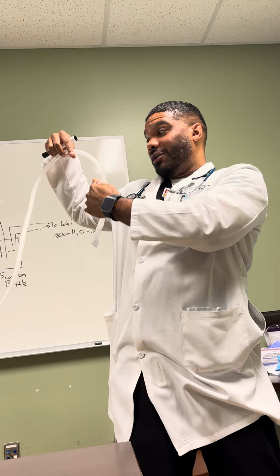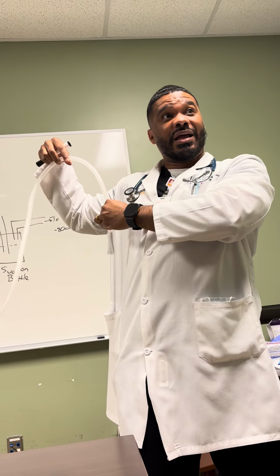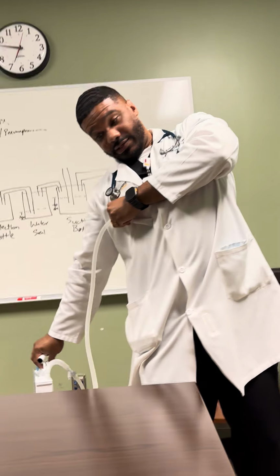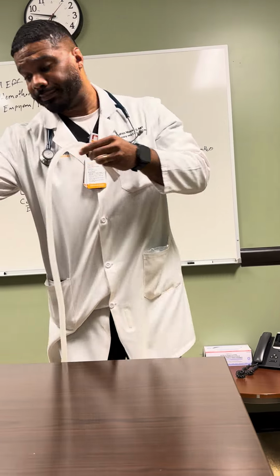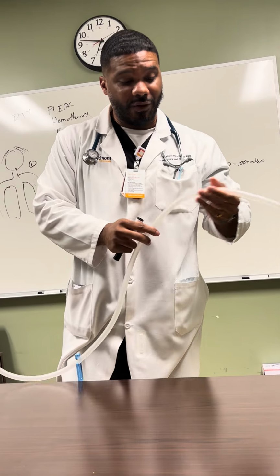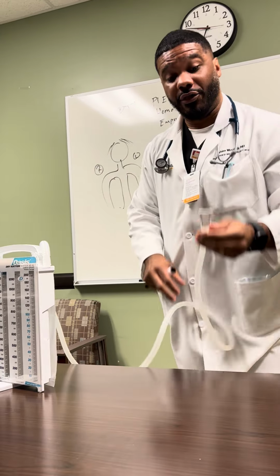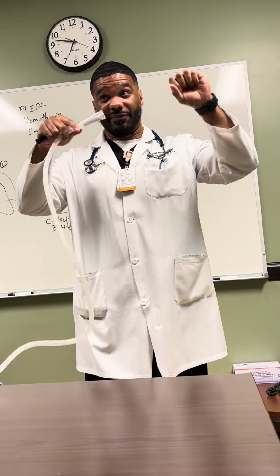That's not going to work because it has to overcome this gravity in terms of draining. So you want to make sure that the chest tube all this is kind of falling downwards, okay, aiming downwards. You want to just assess the tubing itself, make sure that there's no cracks in the system, make sure there's no leaks or anything. Again, another common area where there's problems is the chest tube itself and the connection here.